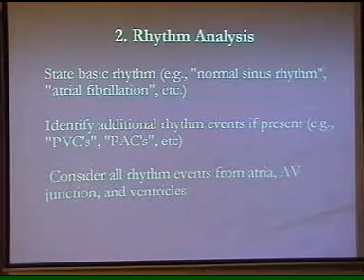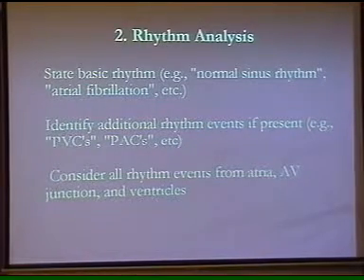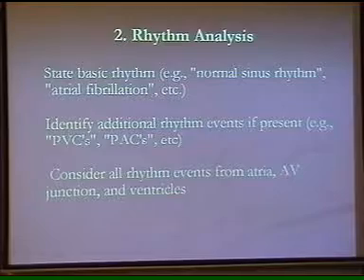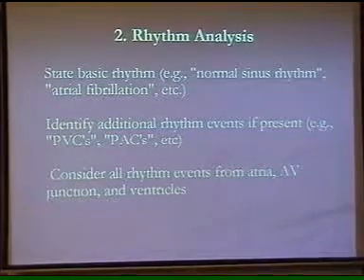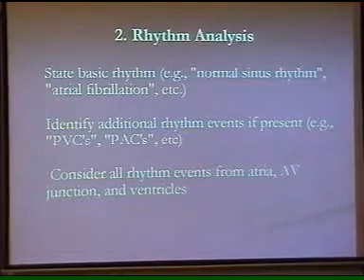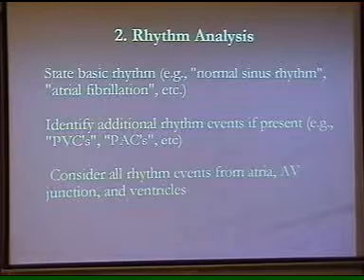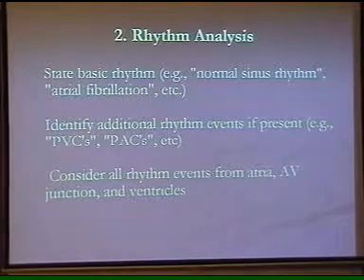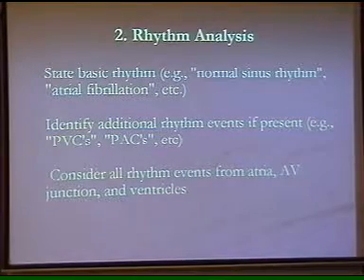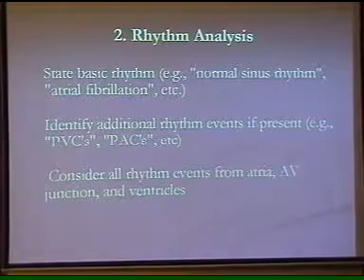And in atrial fibrillation, there's no one-to-one relationship. The atria have got their own way of contracting, and the ventricles are doing their own thing. So whether it is atrial fibrillation, complete heart block, ventricular tachycardia or junctional tachycardia, that's not sinus. Sinus rhythm is one-to-one, P to QRS complex. Each QRS complex should have a P wave preceding it.